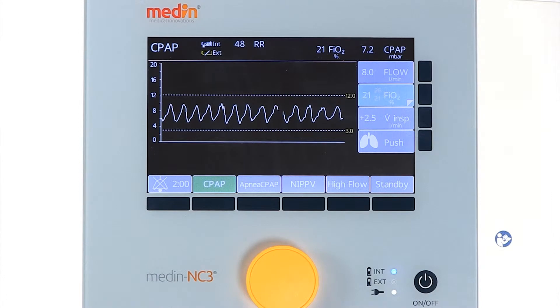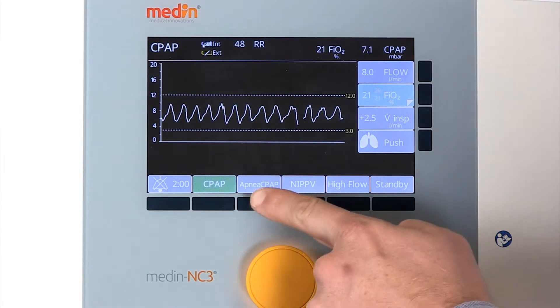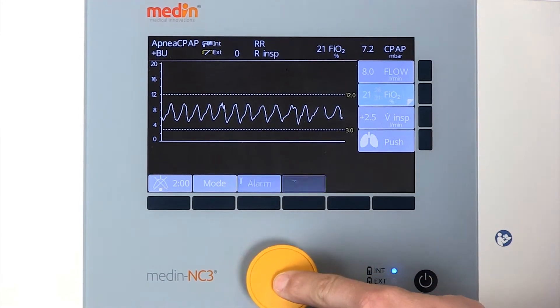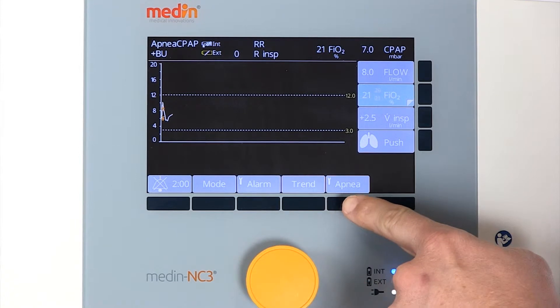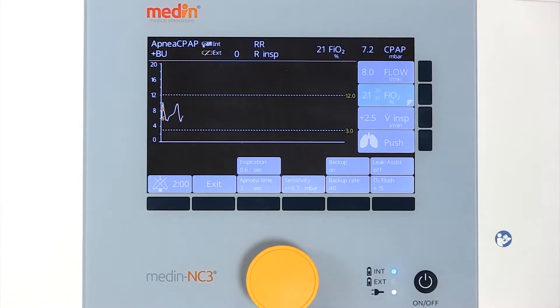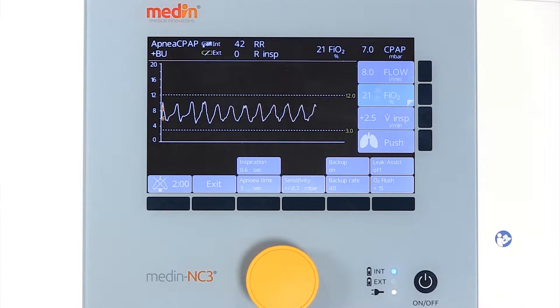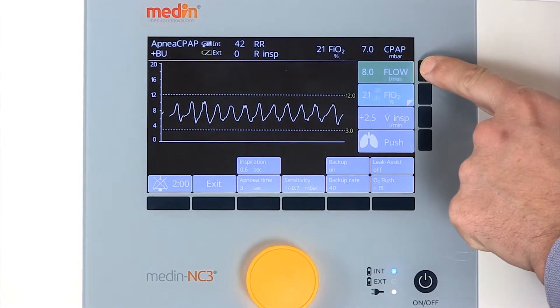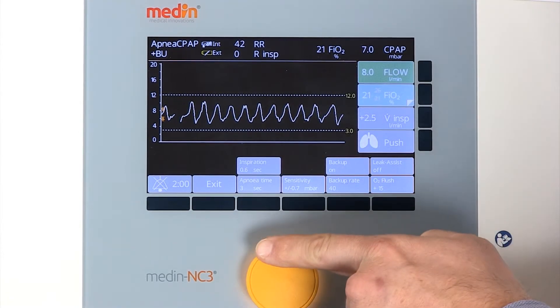The Medin NC3 offers an apnea CPAP mode with an optional backup rate, inspiratory time, pressure trigger, and leak compensation. All of these are manually adjustable. As in all modes, you can adjust the CPAP pressure using the basic flow.